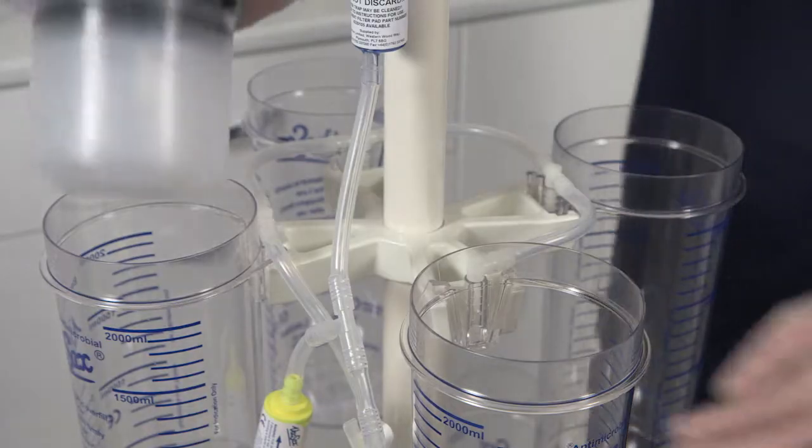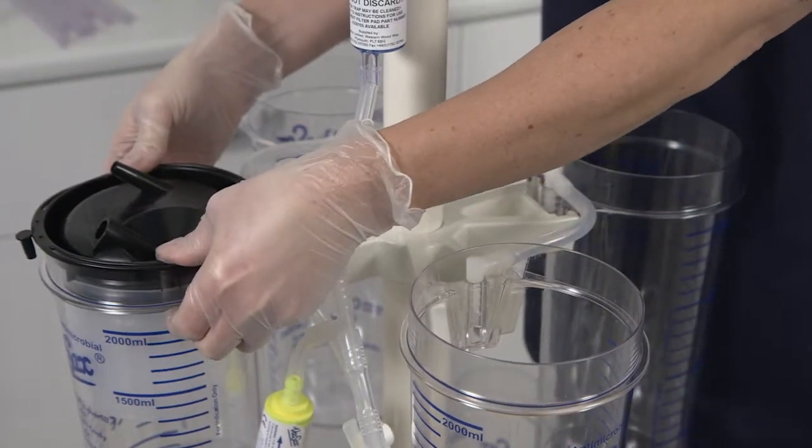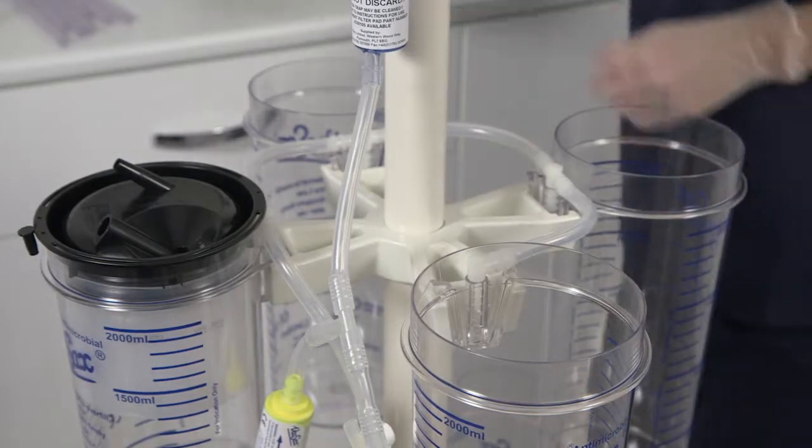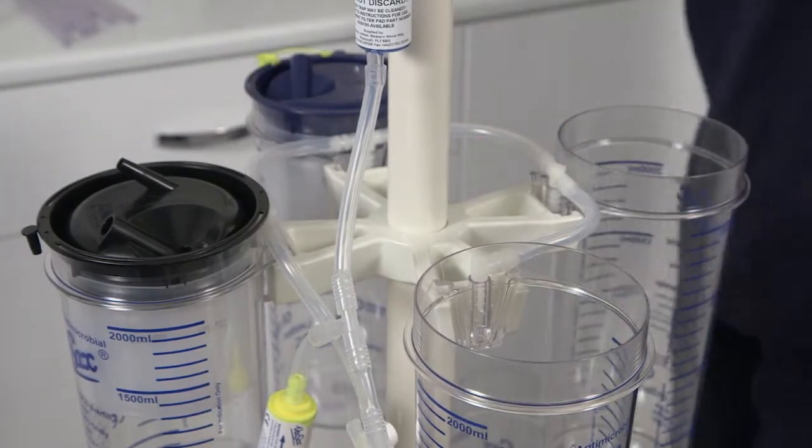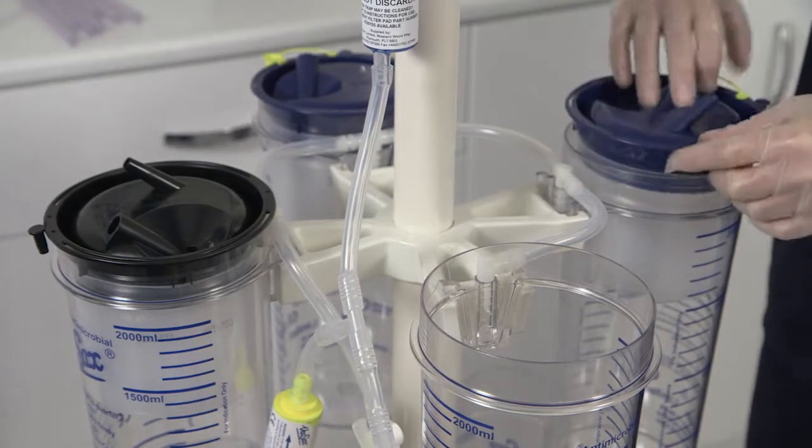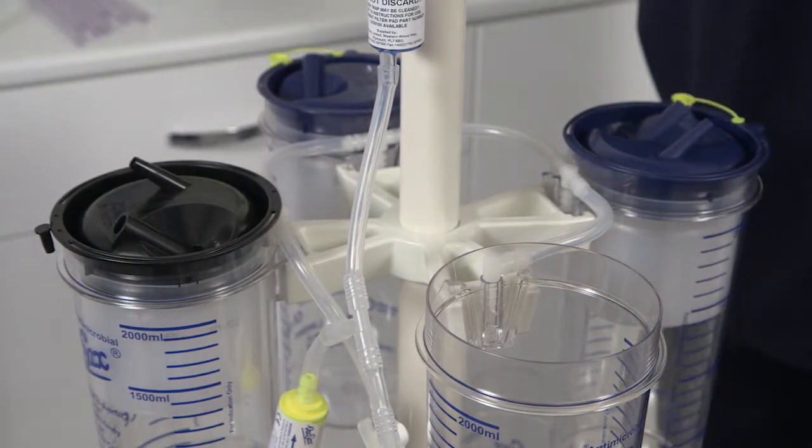The first liner to be put in position is the black lid standard liner which is placed to the left of the suction controller. Then place the remaining three blue lid cascade liners into position pushing them down into the canisters firmly.